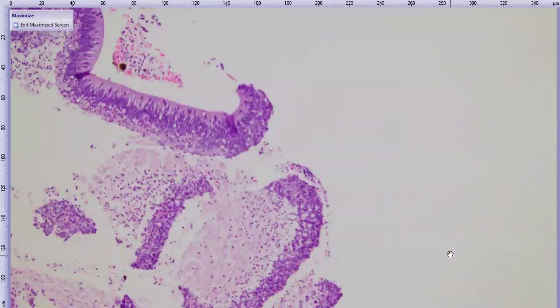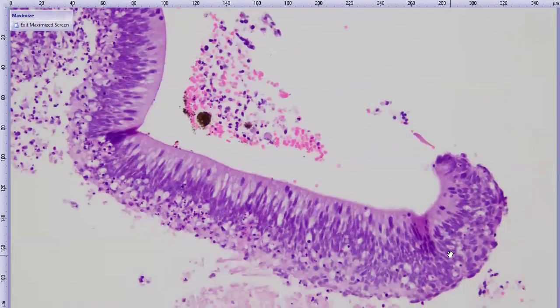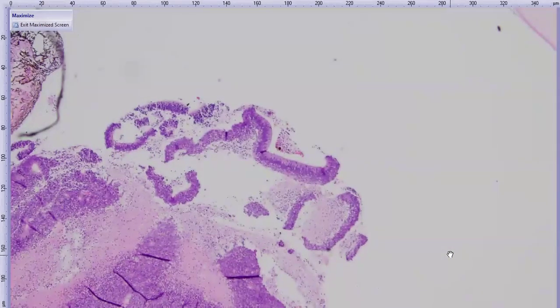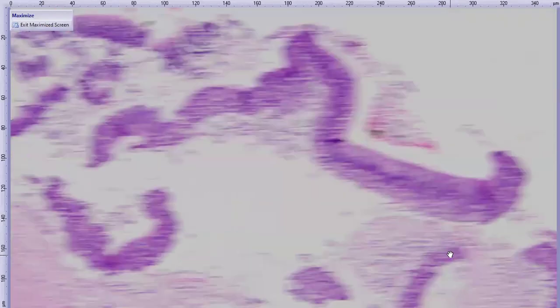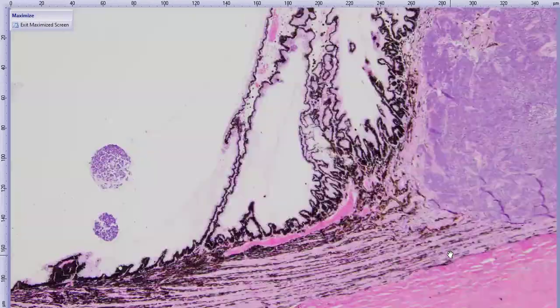And there's one really beautiful area where these cells line up and make this really pretty structure. It looks like retina. It actually looks like embryonic retina, like developing retina. That's kind of cool. Isn't that beautiful? Wow. All right. Those are the fine features there.